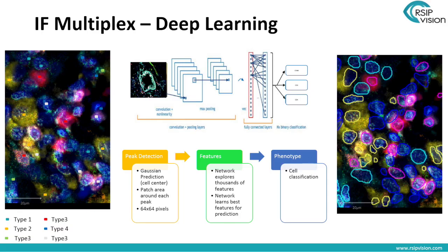So the R&D effort for this type of solution is always going to be a combination of domain knowledge, of semi-specialized manpower, people who have some motivation and background in biology, but not necessarily pathologists themselves, who are doing most of the legwork for the annotation, with an expert supervising it. And, of course, of the R&D team who's tweaking the neural networks, retraining, and especially doing failure analysis.